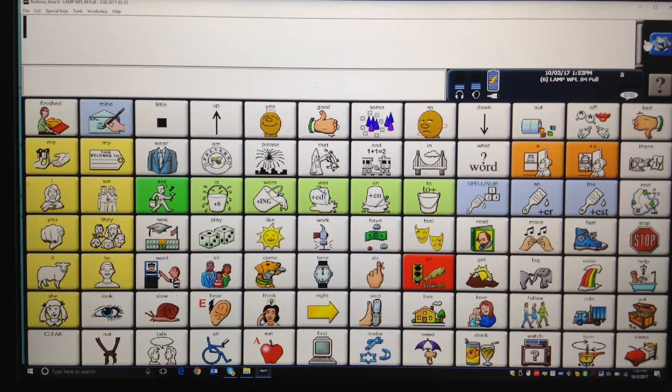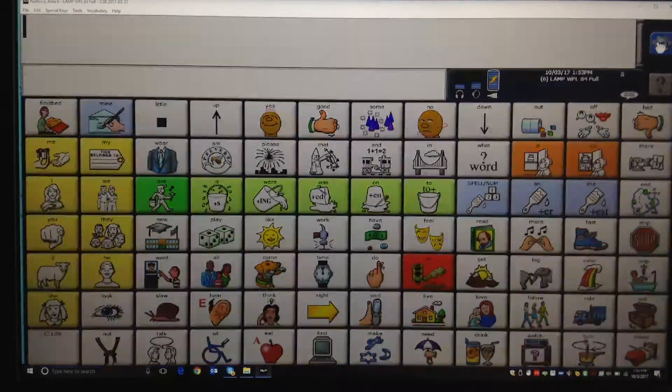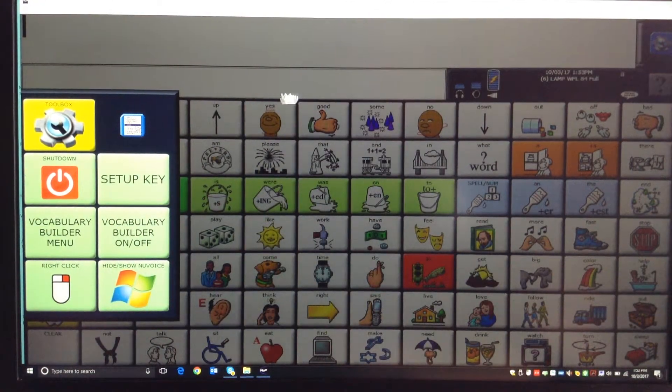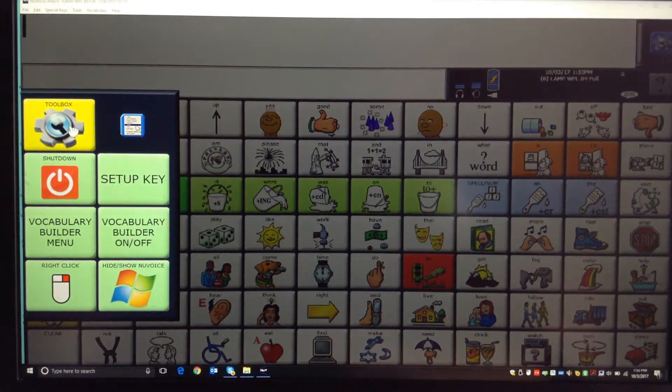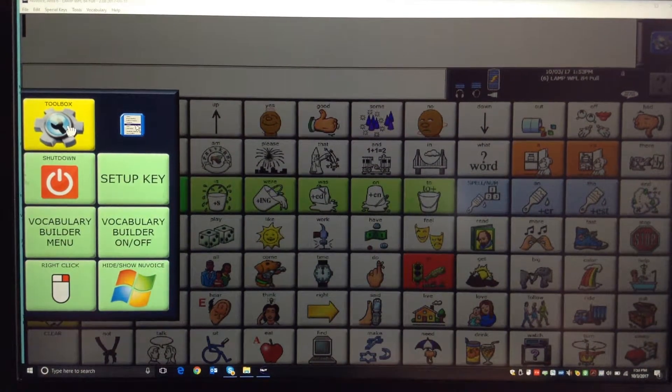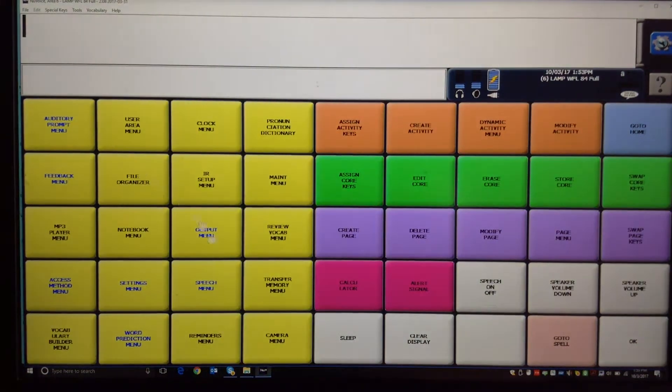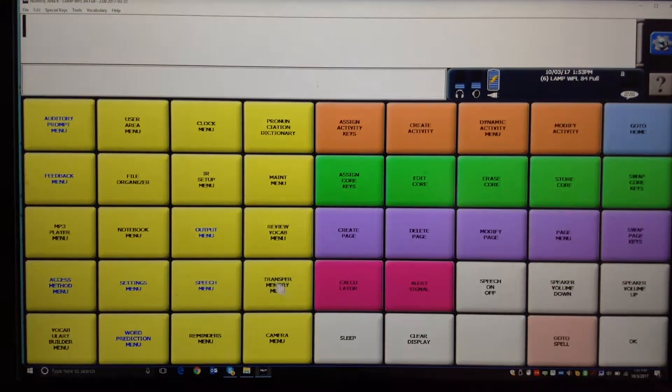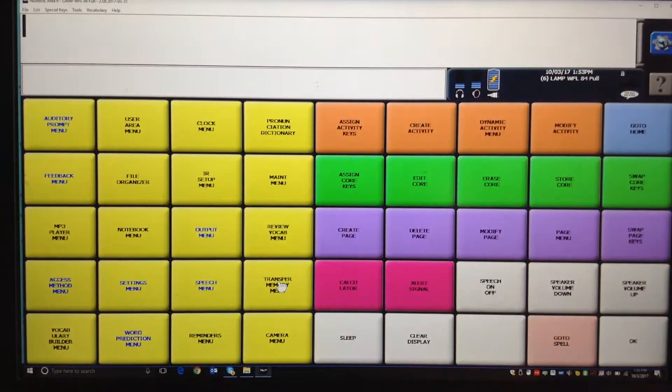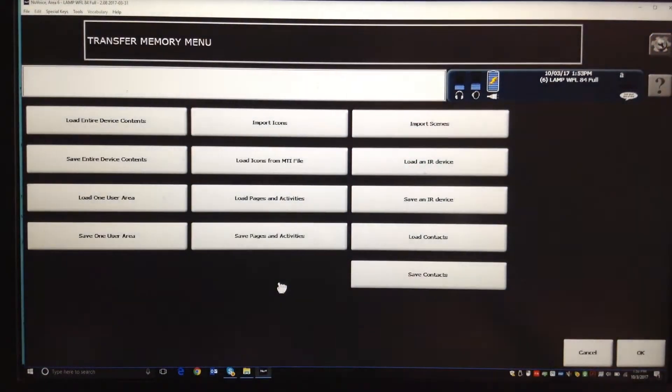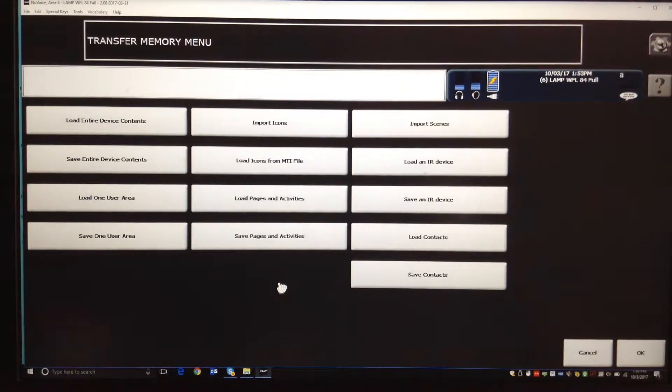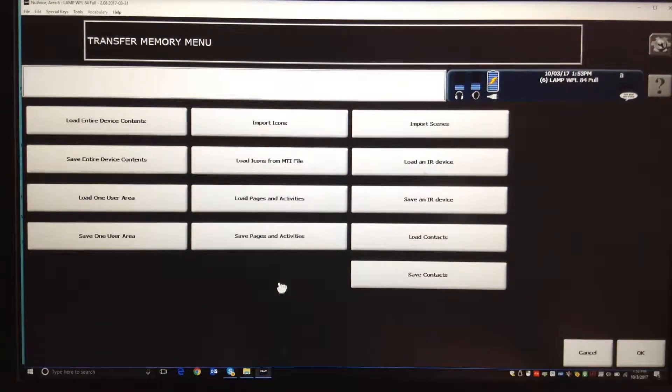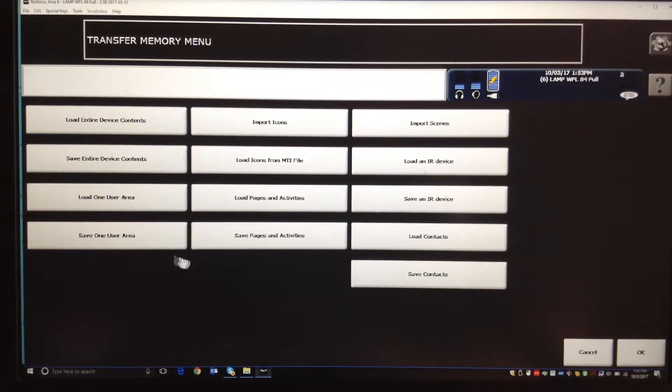Then you're going to click this button, right here with Tools, and you're going to go into the Toolbox. And now you're going to go right down here where it says Transfer Memory. And when you do that, what you're trying to do is save one user. You could save the entire device, but for now just save one user area.